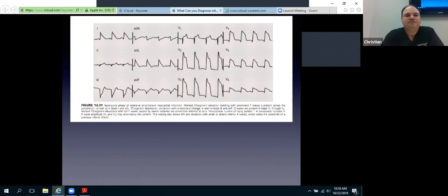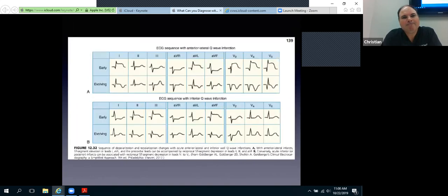Now, you can't mix and match troponins, though. If you do a lab troponin, you can't do an i-STAT, and vice versa. Right, same instrument has to be used. It's also why the same is true for EKG instruments, technically. So when the pre-hospital EKG is done, we're supposed to do an EKG on arrival, because we're switching instruments. But here's also an example of an ST elevation MI.